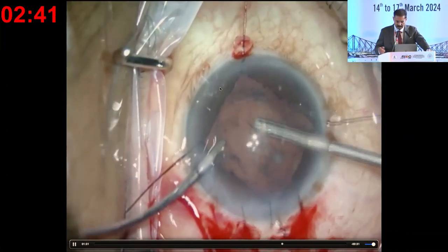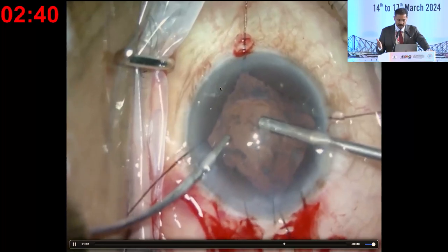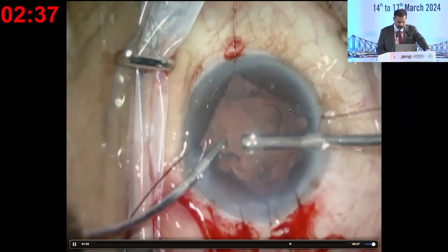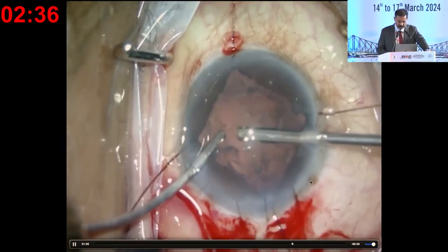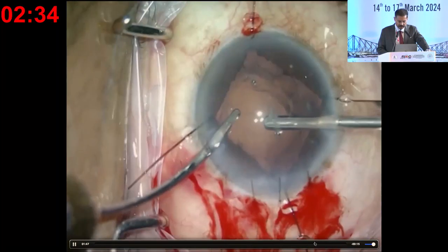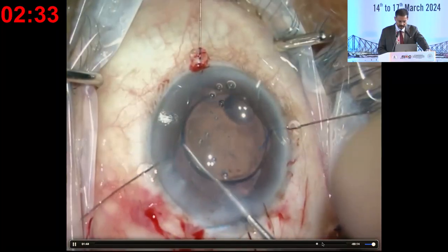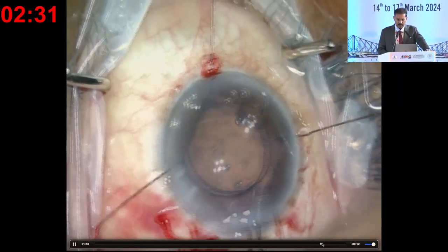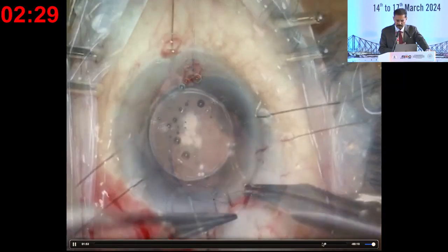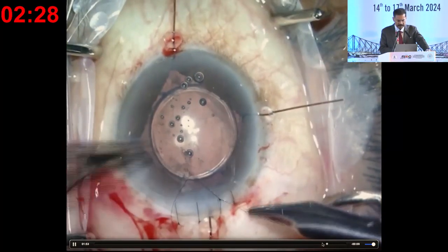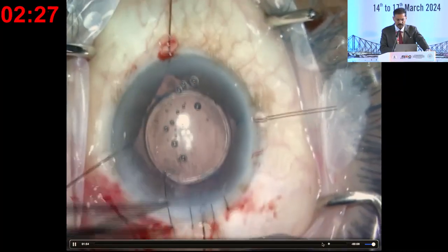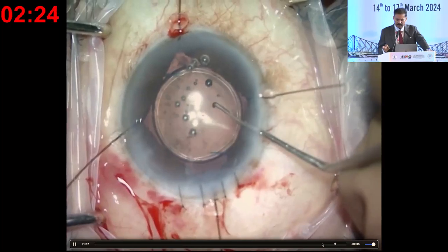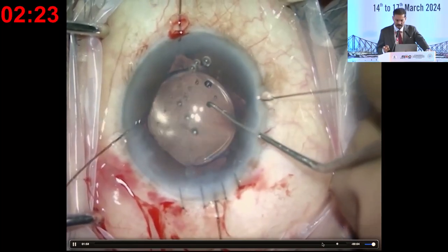Once these nucleus bits are out, we suture the enlarged corneal opening and go ahead with anterior vitrectomy. The details of anterior vitrectomy will be covered in a different topic. Once the anterior vitrectomy is done, we make sure the vitreous is fully gone and the lens goes into the sulcus where the rhexis margin is intact. Here the rhexis is too large to capture, but that doesn't matter — even if it is not optic-captured, it doesn't matter.